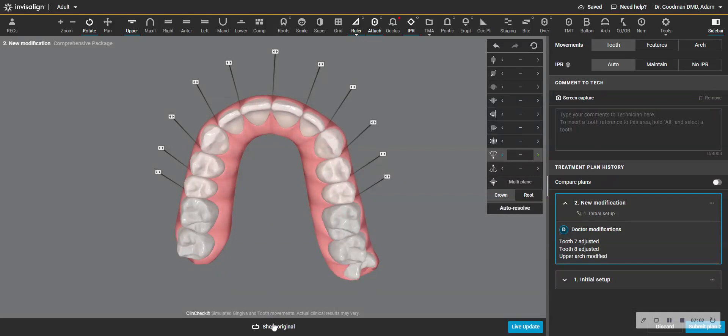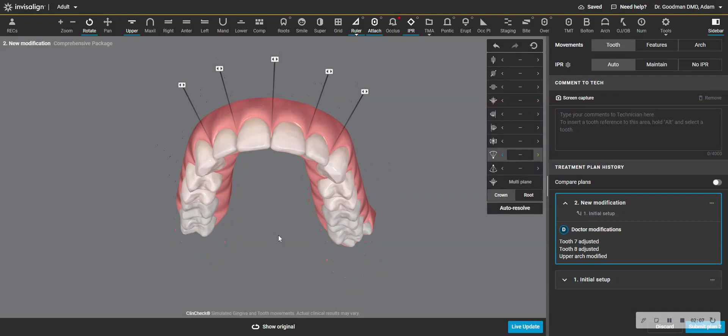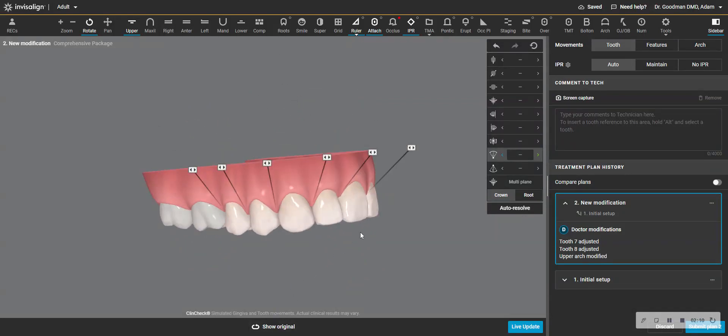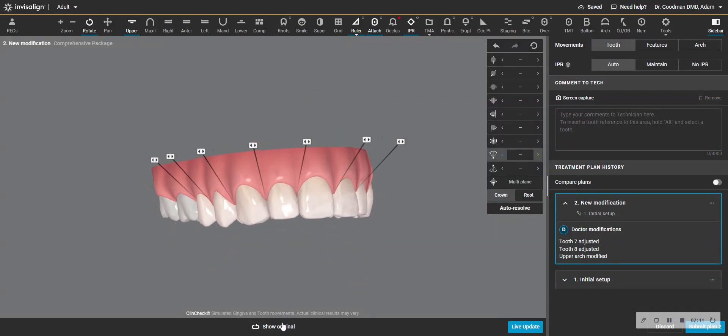And this will have no effect on the case whatsoever, except making it more predictable. And aesthetically, things look fine with that tooth.